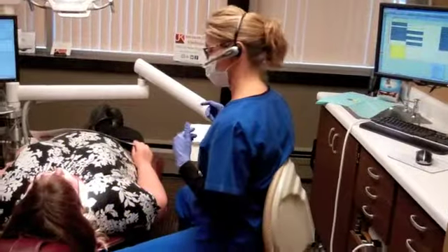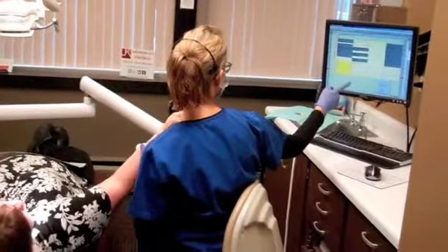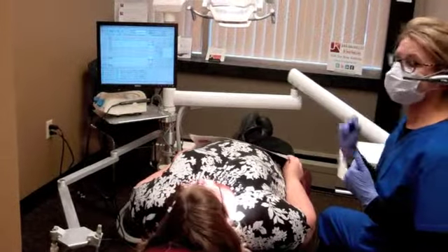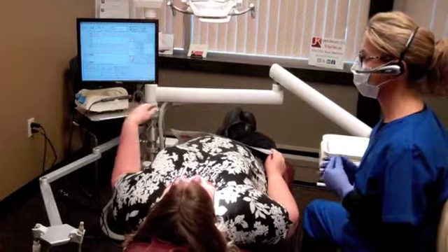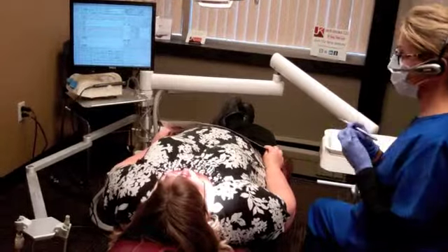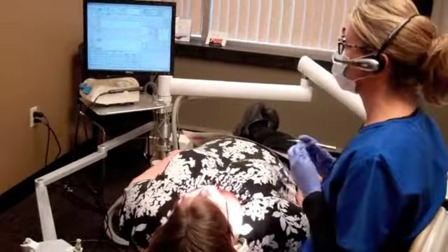Now, Gina has put the headset on. We moved the charting from that monitor to the monitor on the unit, the dental chair unit. This is so the hygienist can track and make sure that the voice activation is tracking everything correctly. Now Gina will demonstrate the voice activation charting.